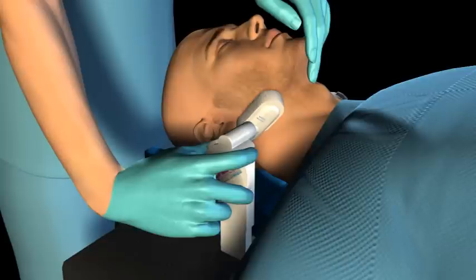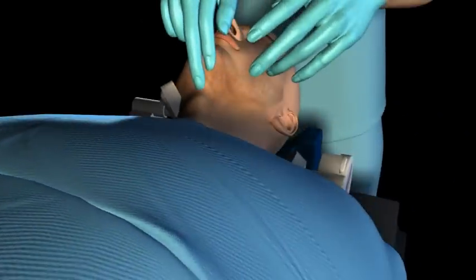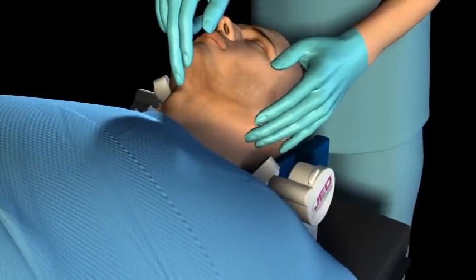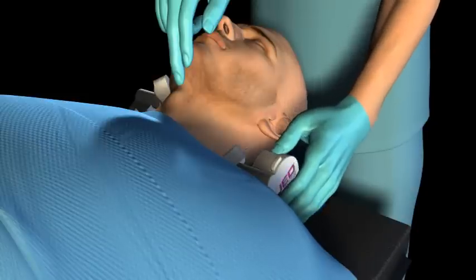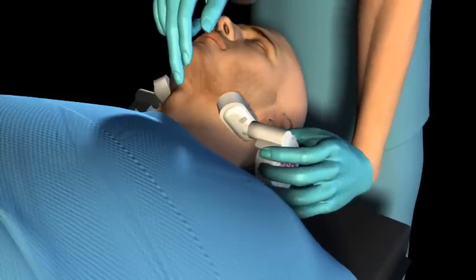While maintaining the proper sniffing position, switch hands so that the right hand is now holding the head position constant. Use the left hand to palpate the angle of the mandible on the left. Next, slide the vertical support arm inward towards the patient's jaw until the mandible cup is posterior to the angle of the mandible. Then lift the arm up and rotate back until the mandible cup firmly cradles the angle of the mandible.